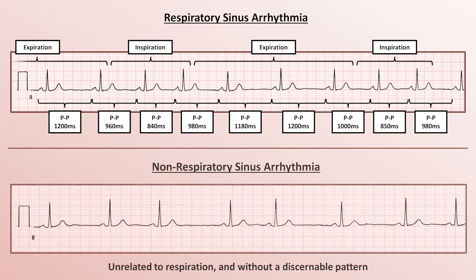Contrast that with non-respiratory sinus arrhythmia, in which there is significant beat-to-beat variation in the p-to-p interval that does not have any discernible pattern. Important to note is that all of the p-waves have the same morphology, implying that they are all originating from the same focus, presumably the sinus node. Both types of sinus arrhythmia are more pronounced and usually easier to identify at slower rates.